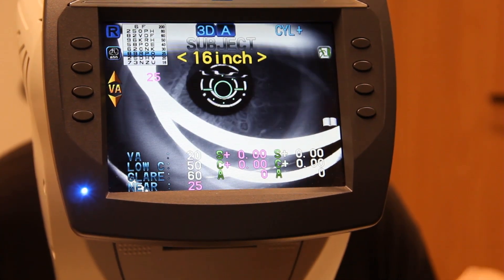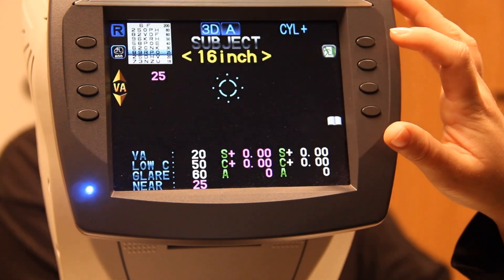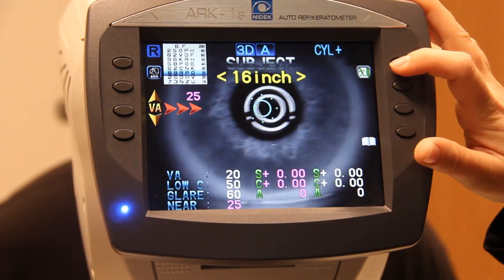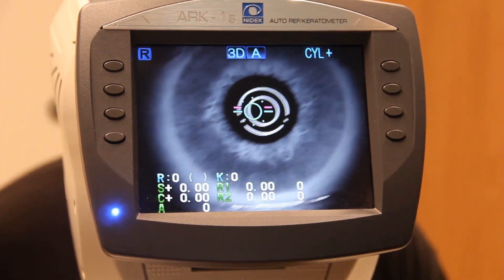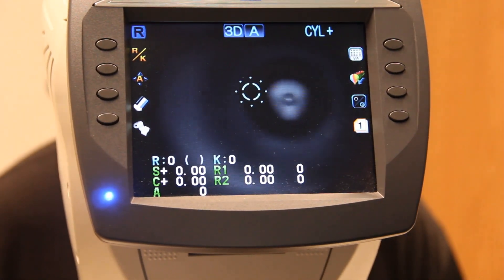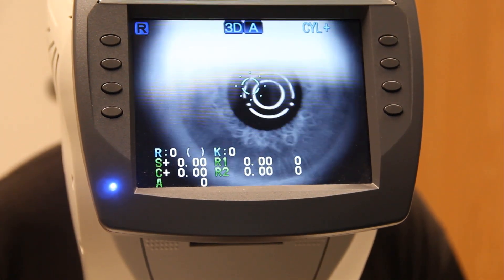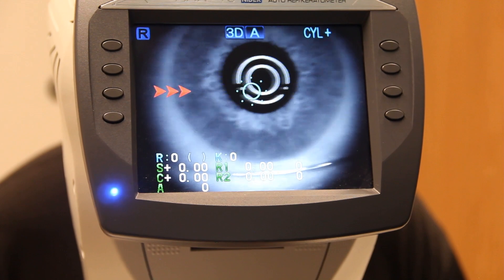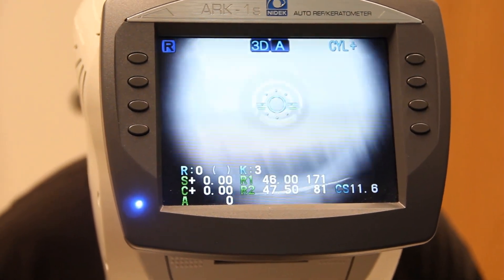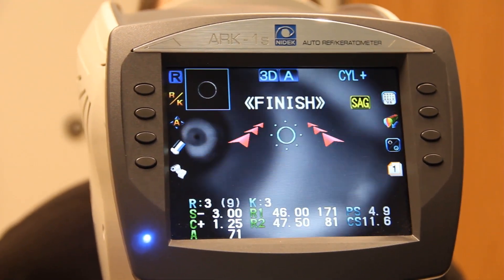Next, have the veteran sit back and take off their glasses, then come forward again. We're going to do this over but now do the refraction part. Same thing — if you're way out it looks blurry; come in until you get that nice yellow, then just hold it there and the computer will take over and do everything. Then do the same thing on the other eye.